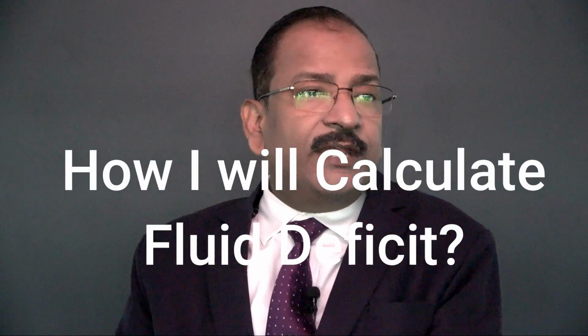If you have a Hysteroflator, it has tubes in and out both connected to your machine, so at the end of surgery it will give you the idea of how much fluid deficit there is. But if you don't have this device, then you have to calculate by measuring yourself. Fluid exit should be collected in a bucket. Always keep a bucket there so that whatever exit fluid there is gets collected, and that way you can measure indirectly. But after some experience you will know, due to duration, how much is inside and how much must have gone intravascular.